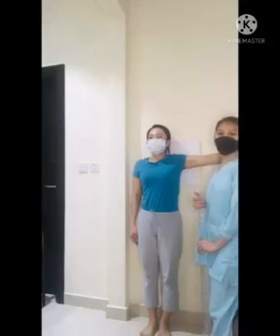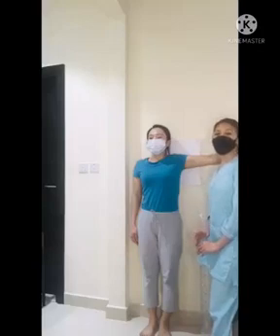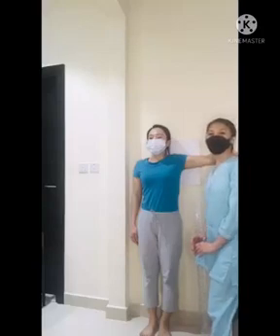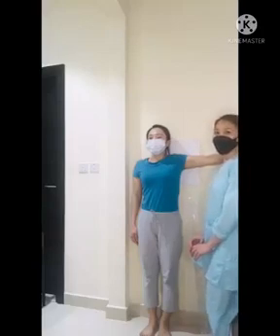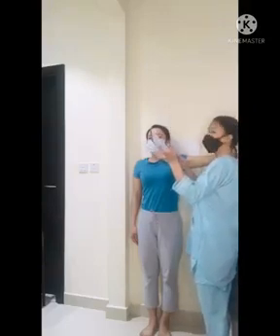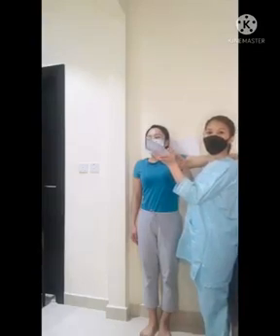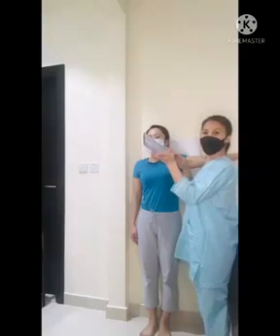So, the body rotation is centered on the scapulohumeral joint. At center of image receptor, the scapula is parallel to our IR. So, the central ray in this projection is the coracoid process, loss of articular cartilage, scapulohumeral joint.